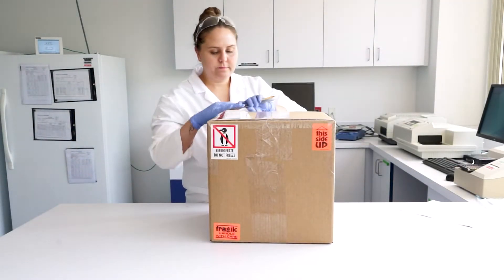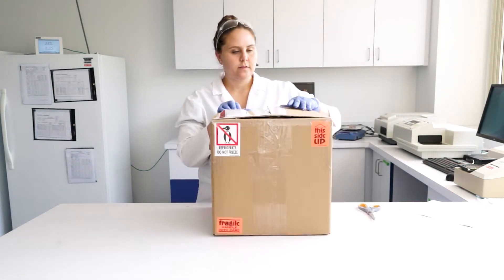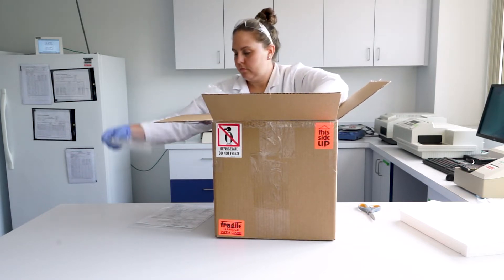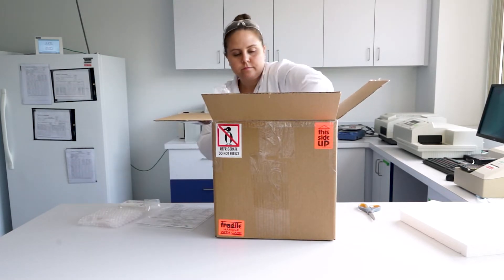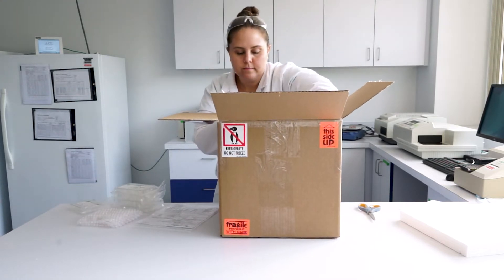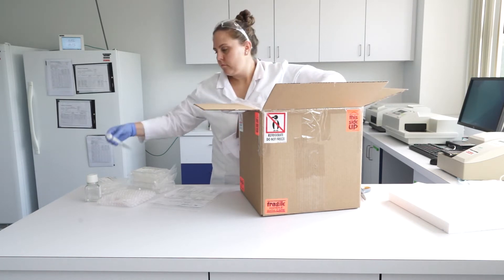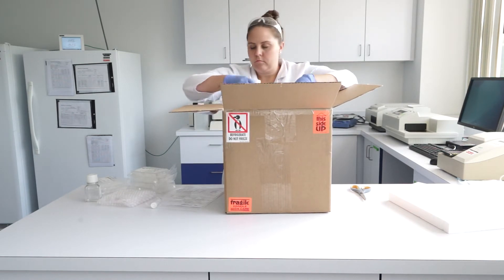Upon receiving your shipment, remove all kit components from the box. Each kit contains one protocol for use with the Epiderm Skin Model EPI 200, 24 ready-to-use Epiderm tissues in a sealed 24-well plate, four sterile six-well plates, one 100-milliliter bottle of PBS rinse solution, one 10-milliliter conical tube of 1% Triton X100 solution as an optional test control, and one 50-milliliter bottle of Assay Medium.